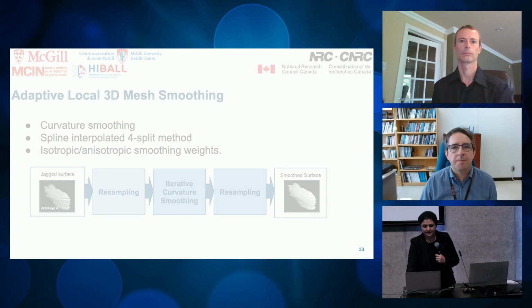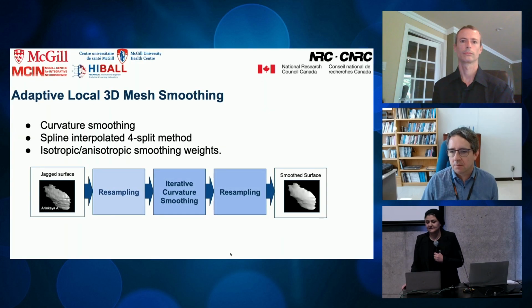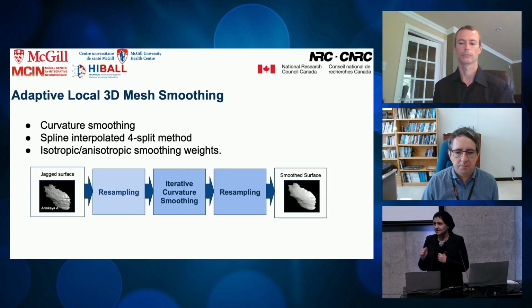The other work that we are working on is, as I illustrated before, when the researchers and scientists paint the 2D boundaries of the segments, and we create 3D, we will see lots of jaggies in the 3D surface.